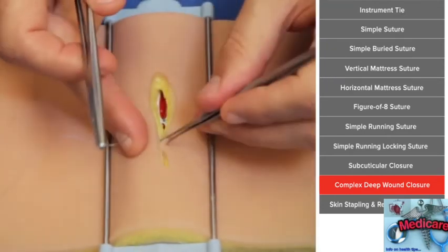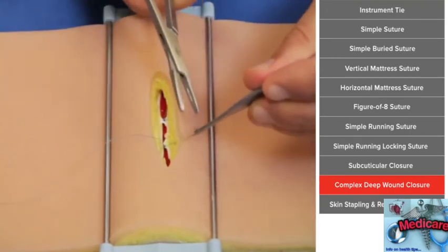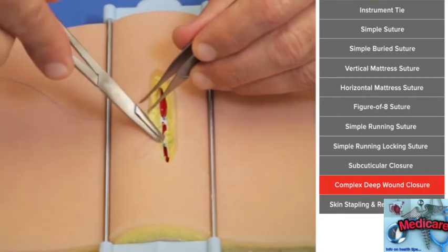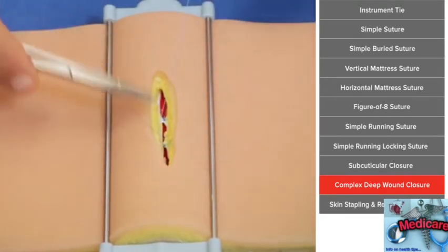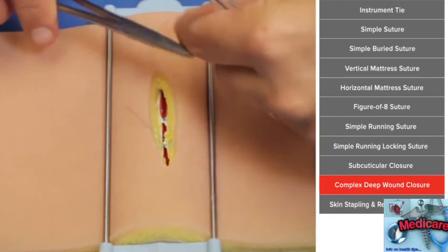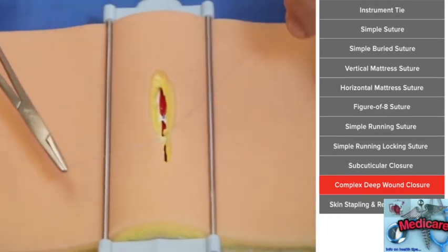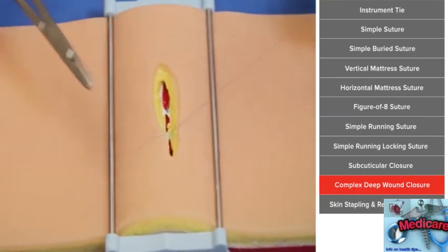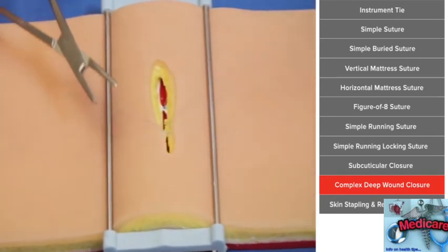Once the fascia is closed, you kind of have a decision to make. You can go right to the dermis, or you can look for, in some parts of the body, what's called Scarpa's fascia. So you could potentially close another layer. Here I'm going to close the deep dermis, and it's going to include some of that fatty tissue, which would theoretically be like a Scarpa's fascia. But the dermis is the strength here. Again, this is a buried knot, because this is the next layer of closure. So we started deep and went superficial, and then superficial and deep.